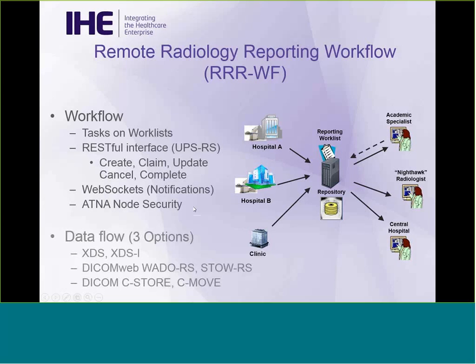So we thought about this in two pieces. There's the data flow component and the workflow component. So the data flow is pushing the images and pulling the images, getting the images from where they're created to where they're going to be read. And the profile describes three options.